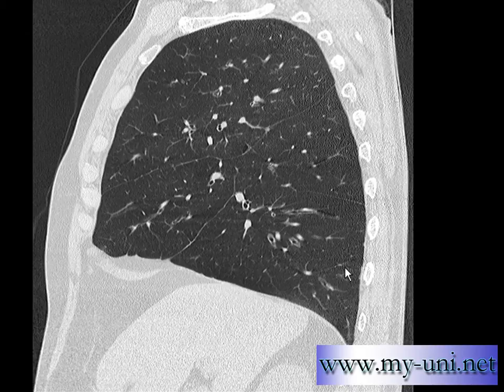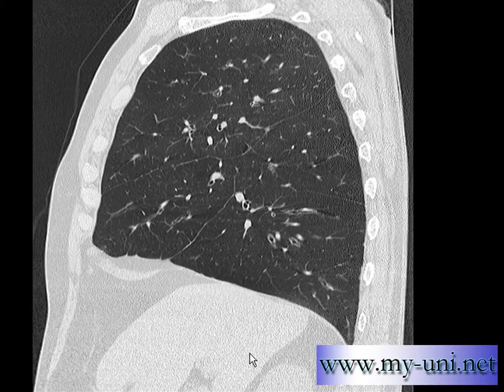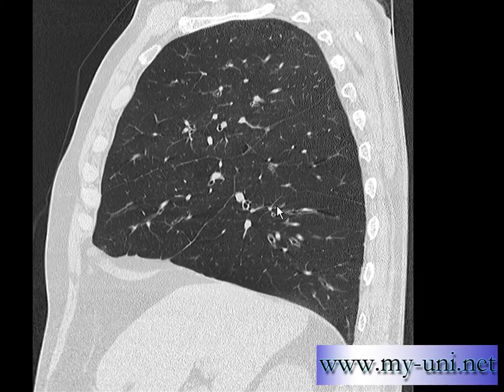This is a set of sagittal images, as we call them. These images are acquired as volume data, and with the help of the computer that comes with your CT scan machine, you can reconstruct this data as axial, coronal, or sagittal sets of images. They are also known as MPR — multi-planar reconstructions.